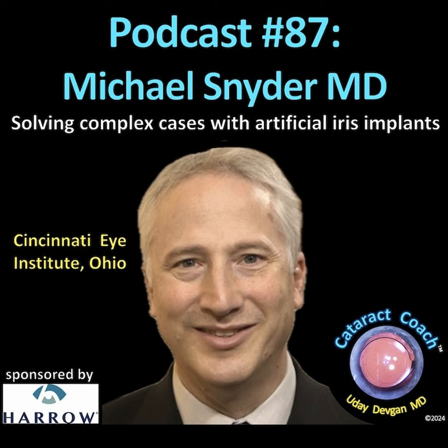Right. The caveat, though, with Gore-Tex, if you haven't worked with it, for our listeners, it's slippery. You make sure your knots are square and tight. You are so right. And interestingly, if you look at the labeling, and I personally almost never read the entire labeling that things come with, but my friend Greg Ogawa does. He's the guy who reads that stuff. I remember early on, he told me, Mike, the manufacturer recommends that you put 7 separate throws in to lock this knot. And while that's actually designed for cardiovascular use, I usually will put in 5 throws. I usually do a double wrap and then 4 single throws to follow.